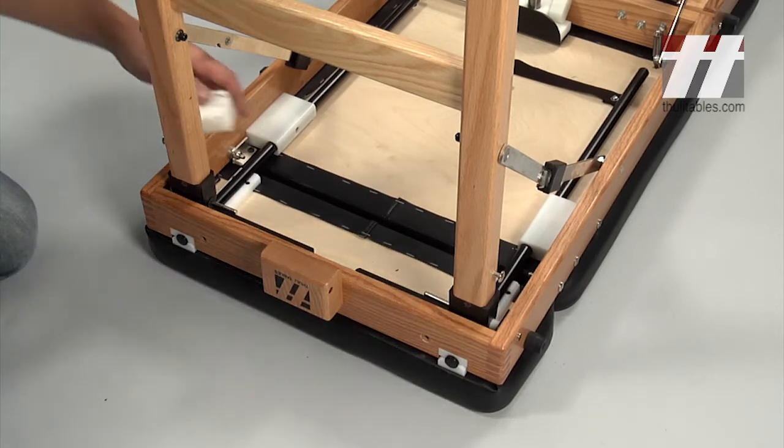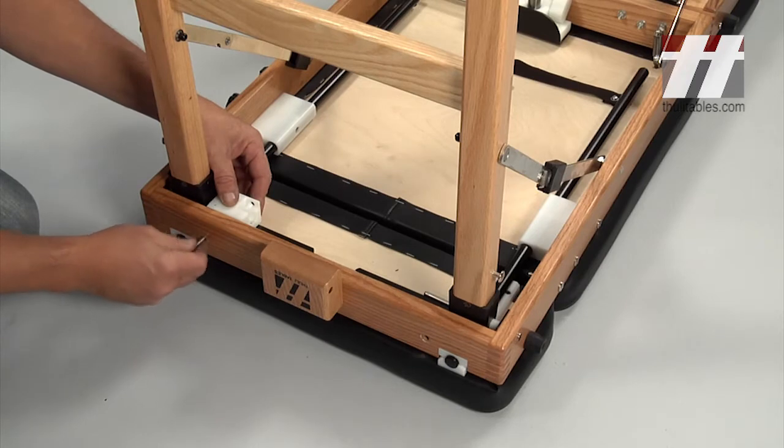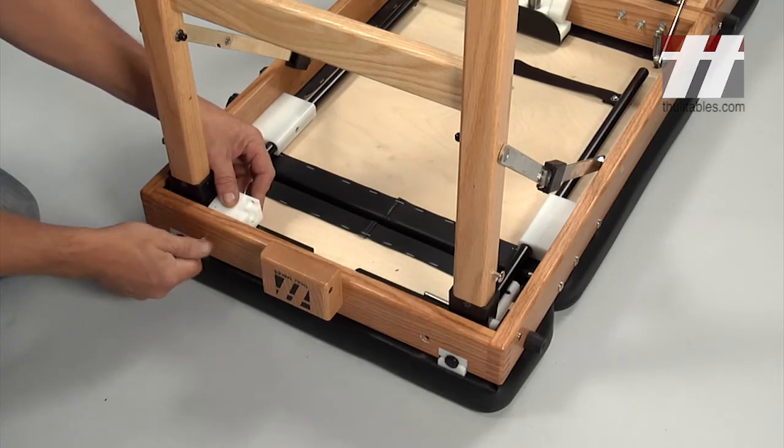Next, attach the mounting blocks. Slide the blocks onto the leg pins so that the slot in the block faces the ceiling and the center of the table.